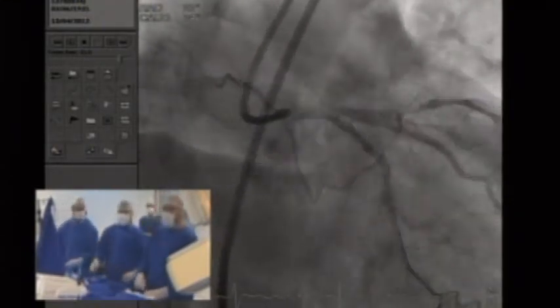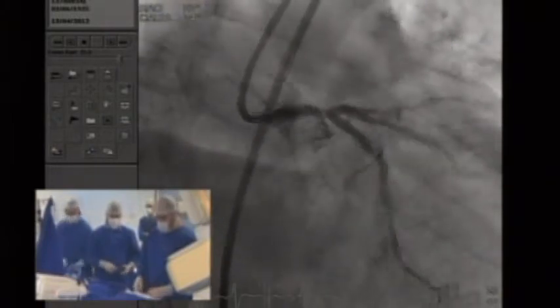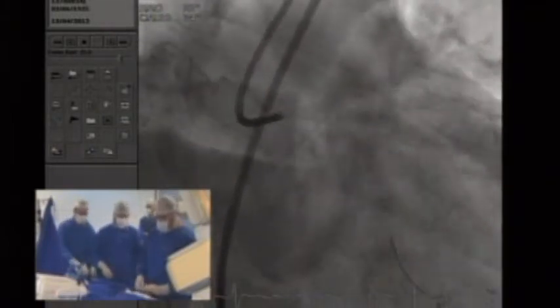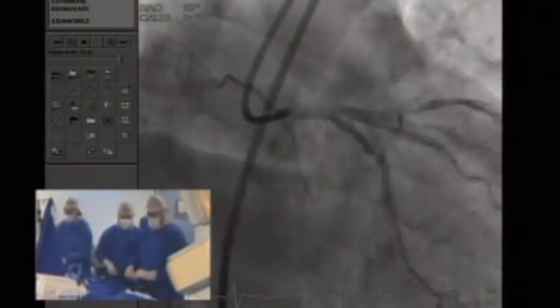Because you can talk to the family: there is this situation, restenosis is X, stent thrombosis is Y. I think this is a good candidate for surgery. What do you do? Surely I would consider surgery for this case if I don't have DES to use there.